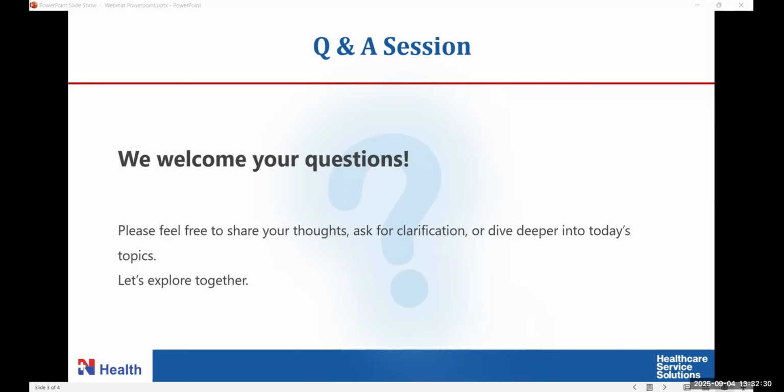And the next question is, what will be the best recommended fixative for the immunofluorescence in your practice? What would you recommend as the best fixative for the immunofluorescence stains? Could you please suggest? We get fresh tissue. Yes, we get fresh tissue. And at the lab, I think there is a type of fixative used in what we send to Sri Lanka.